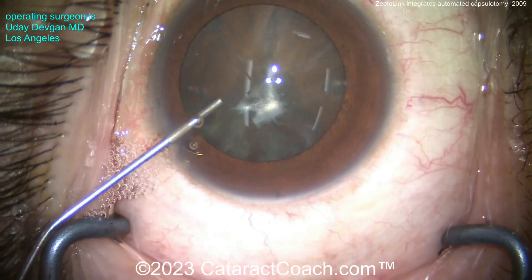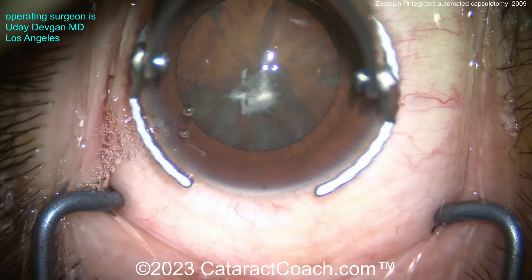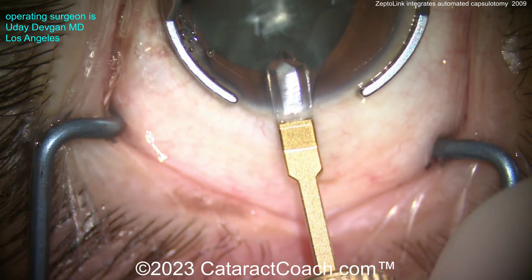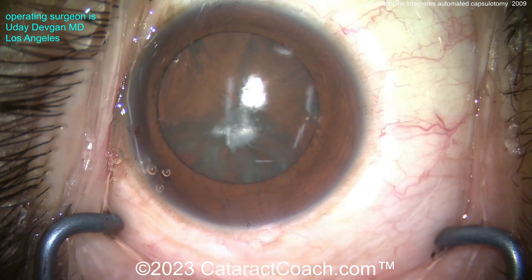Let me show you a case here. This is a patient with a very tough case — a scarred, fibrotic anterior lens capsule — and the patient's other eye had surgery elsewhere and had a lot of problems with a broken capsule, dropped nucleus, full vitrectomy, and a sutured lens. We don't want that to happen to this other eye.